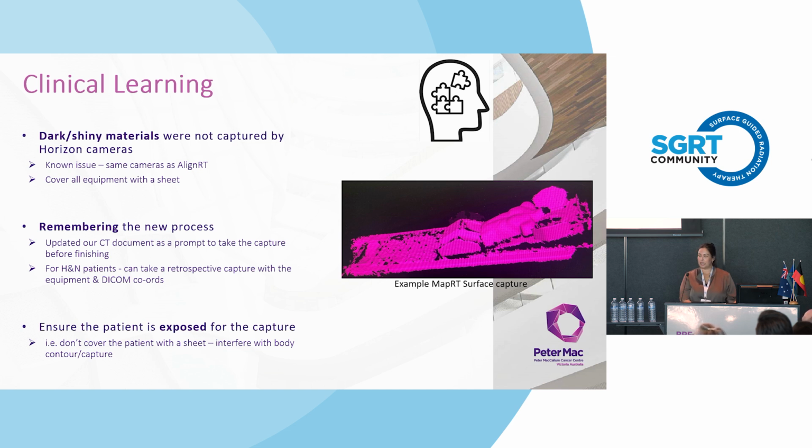Interestingly, we also found that the MapRT captures can be taken retrospectively for any patients that have personalised equipment, such as your head and neck patients. We were then able to use their equipment and the CT DICOM coordinates to take a useful capture retrospectively.